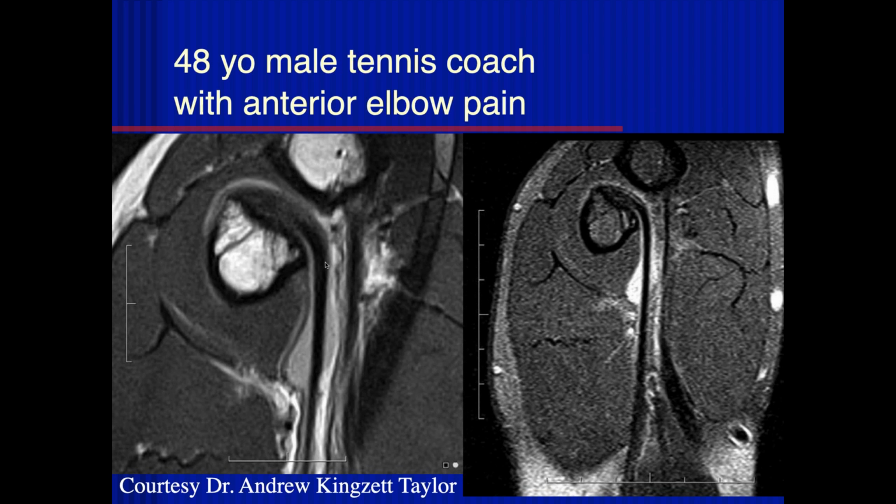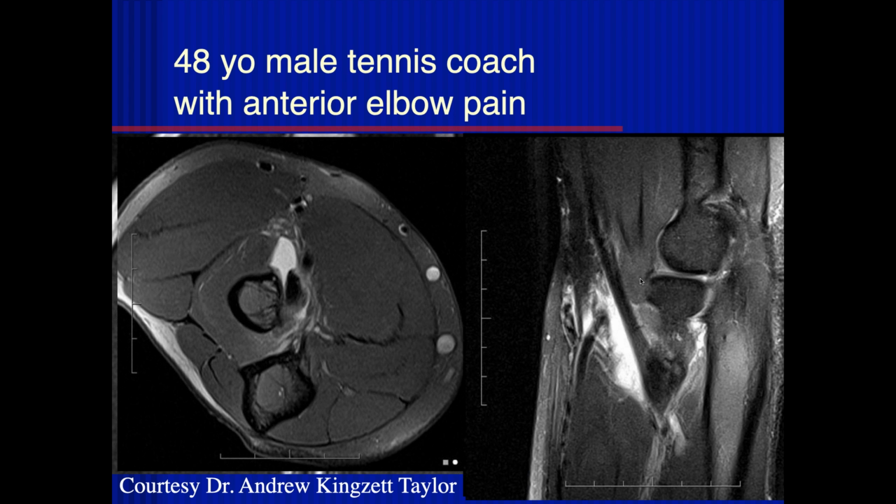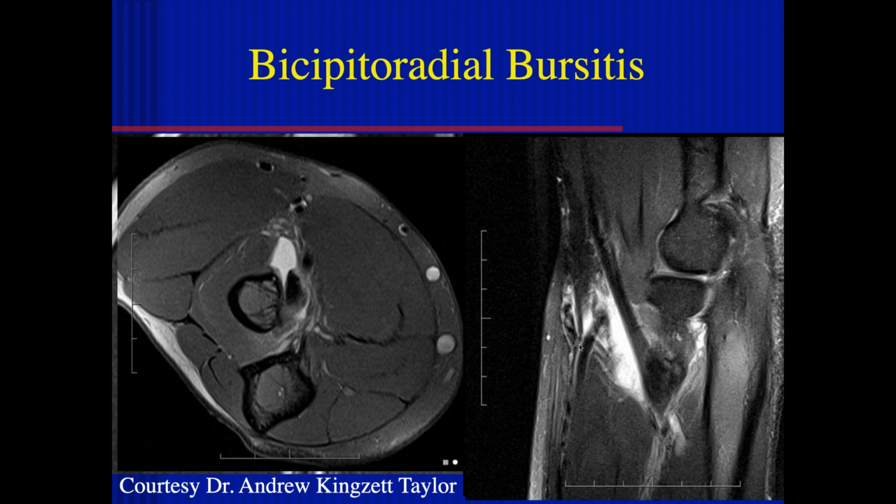All right, so I see just fluid along the tendon. Okay, and then maybe there's some increased signal at the tendon at its insertion to the radius. Yeah, so this is fluid, like in the bicipital radial effusion. This is often called the bursal effusion. It's probably partial tearing with a little bit of hemorrhage and irritation of the bursae in this area.